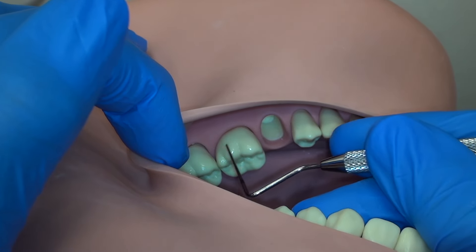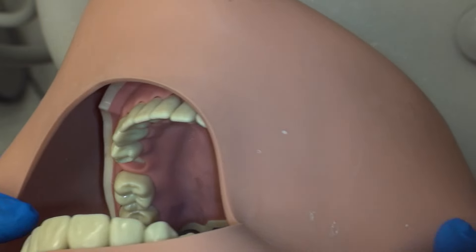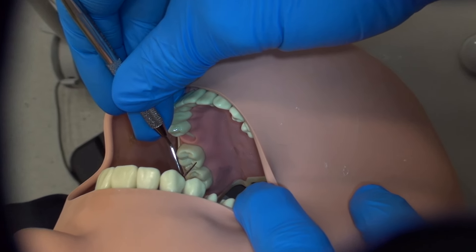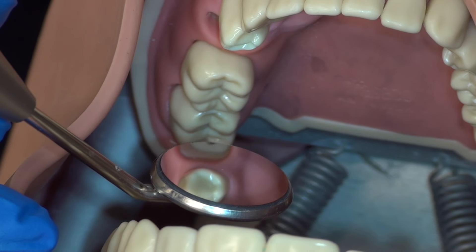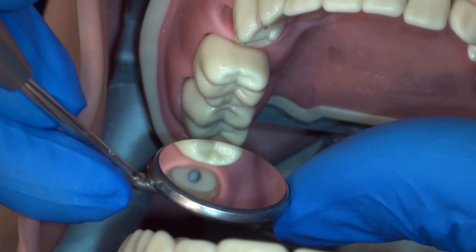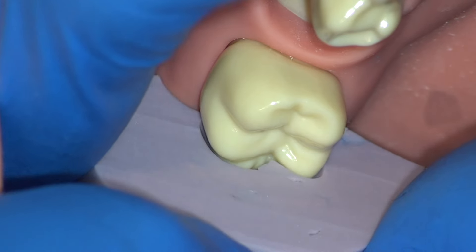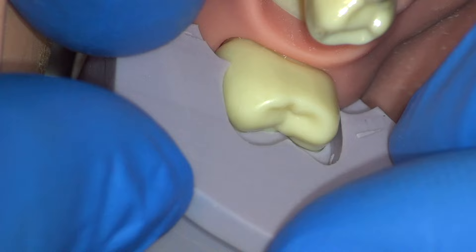The mirror will not be utilized to view any portion of this preparation. For the lingual portion of the preparation, the head is rotated to the left, and visual access is gained looking past the maxillary anterior teeth. This view gives us access to the remainder of the distal lingual finish line. During and after preparation, our finish lines are assessed circumferentially from the occlusal view with the mirror, as well as checking for a coincident path of insertion and any undercuts. Finally, ensure that the fit of our putty matrix is perfect with the tooth — it should be trimmed fairly close to the cervical of the tooth and fit passively against the gingiva.